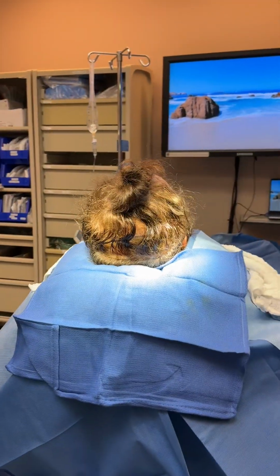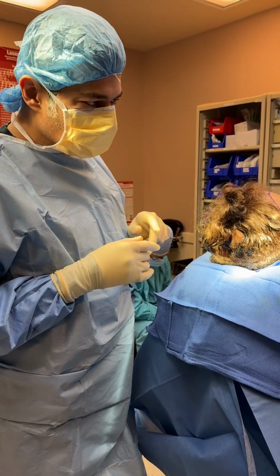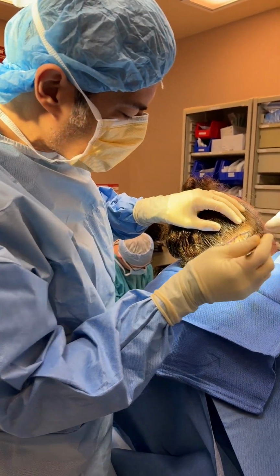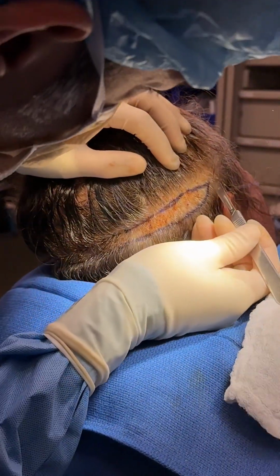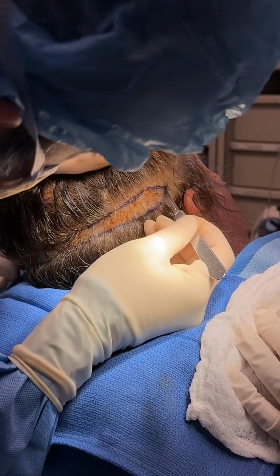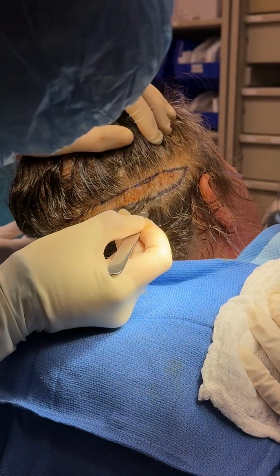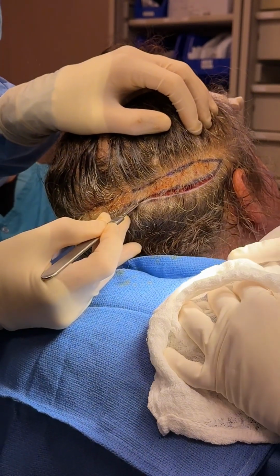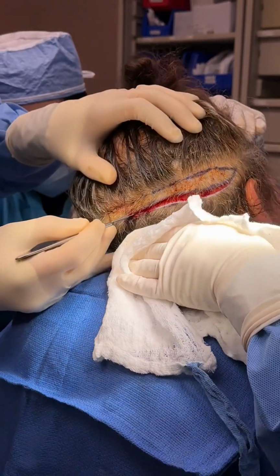All right, friends, we're doing a 3,000 graft follicular unit transplant today. We'll be making our incision first. We're going to use a number 10 blade, and what I'm going to do is make a trichophytic incision, or an interlocking, interdigitating incision. I'm going to start from here. And I'm cutting at an angle, so that way the hair from the top and bottom of the scalp can lock in together.